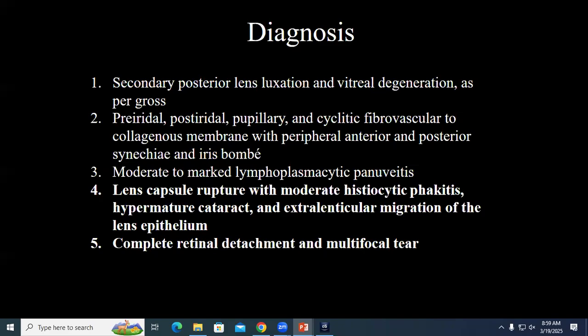And they had a question about ERU, or equine recurrent uveitis in this case, because the other eye has some inflammatory seeming signs. I didn't see an amyloid carpet along the ciliary body surface in this case. There was a lymphoplasmacytic uveitis, so there is a uveitis at least.